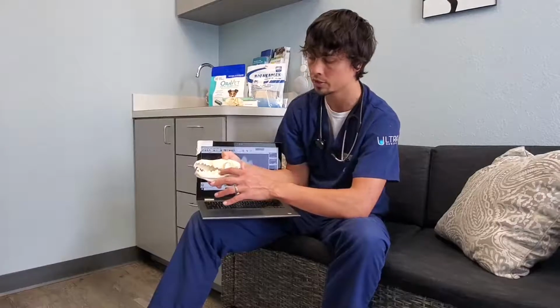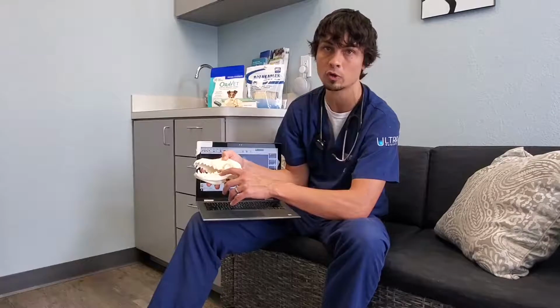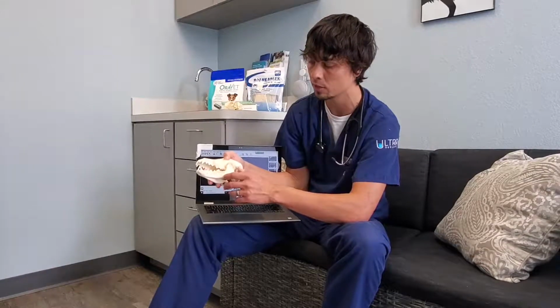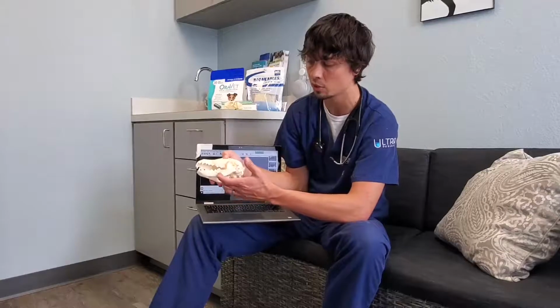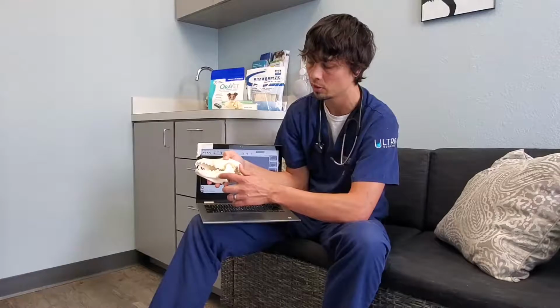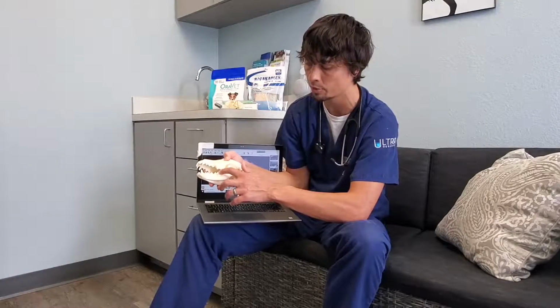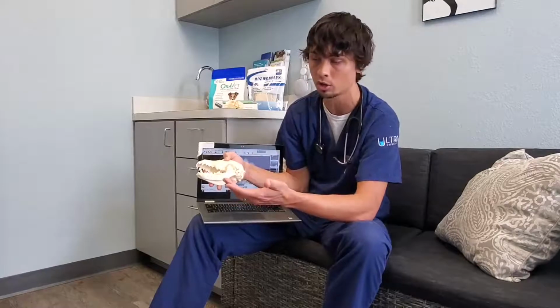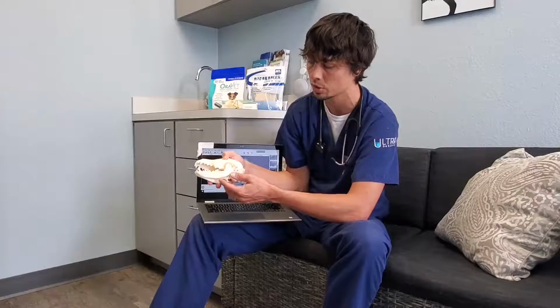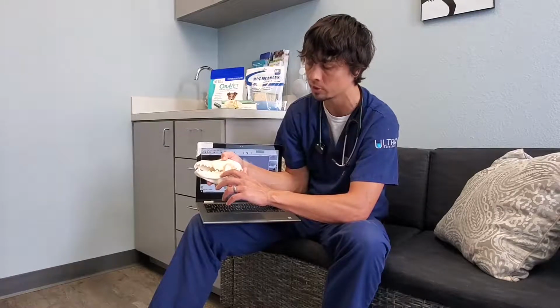I want to hone in on this tooth right here. As an example, this is a really big lower first molar that is involved in chewing in the back of the mouth. And you can see this is a healthy dog jaw, and you can see all of the bone right here to where you can't see any of the root structures. This is the crown, or the part of the tooth that you can see in a normal dog, and then everything here underneath the bone is the root structures. So in a normal healthy dog, you want to see the bone covering up the root completely.